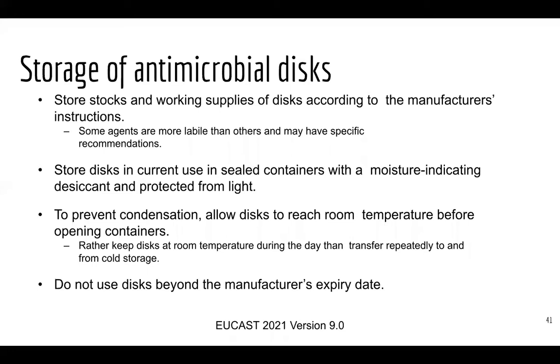I do this a lot if it's in the minus 20, for example. If it's a powder, a lot of the time it'll pull the moisture in from the air and get wet. So this is a general rule, not just for discs but for lots of things. If you can, leave your sample outside for as long as possible until it's got to room temperature, and then open it so the moisture isn't taken in. Especially true for dry powders.